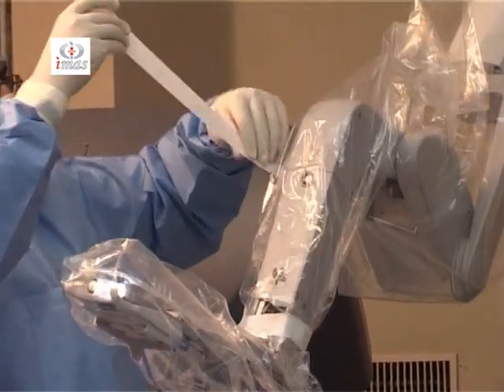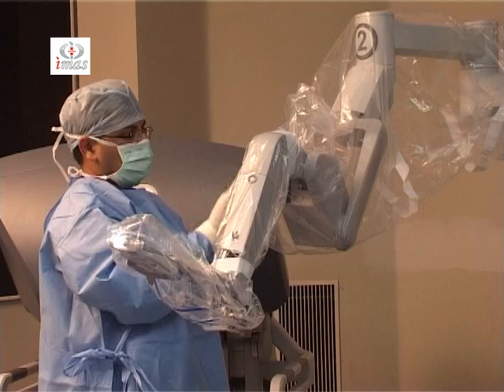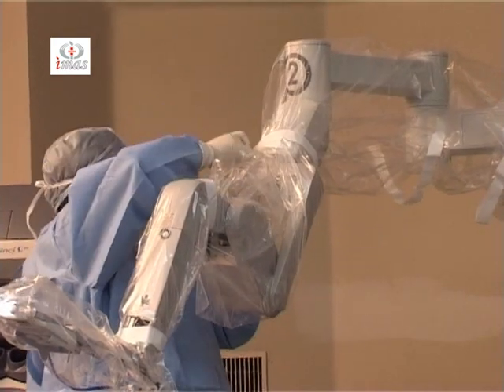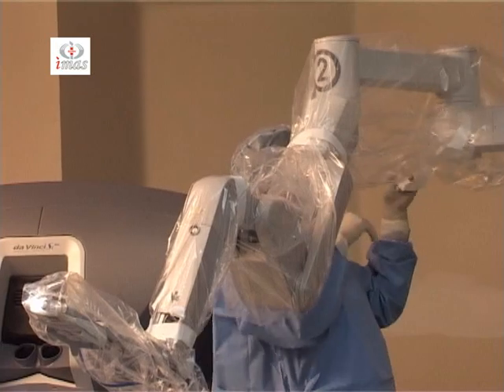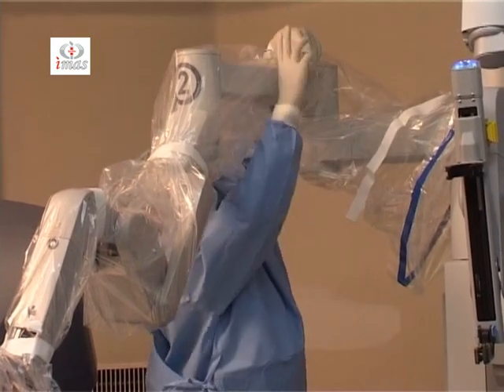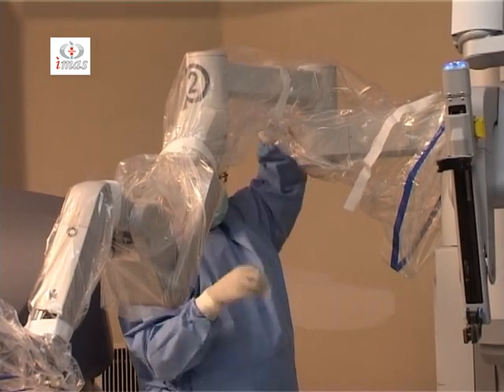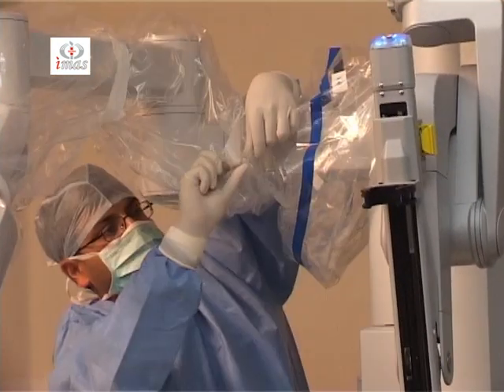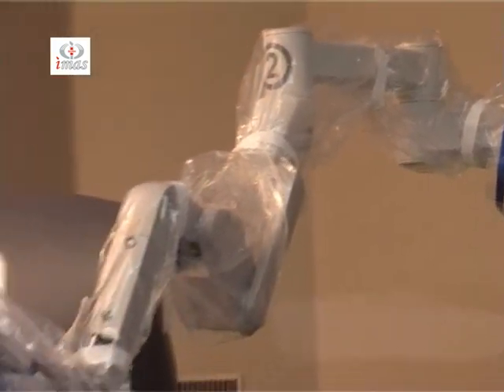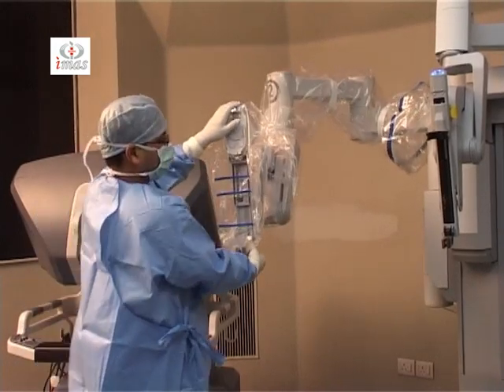Care should be taken not to strap around the port clutch button. These have to be strapped all around. They hold the camera drape or the instrument drape in position. And then the arm is taken to its proper position.